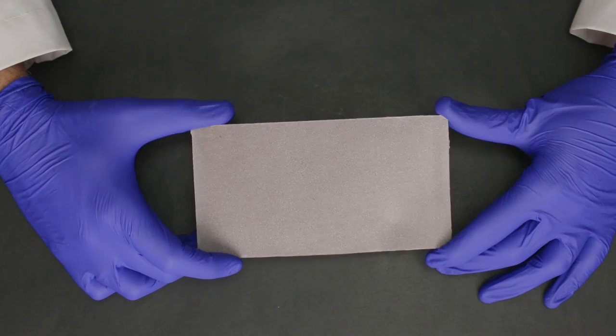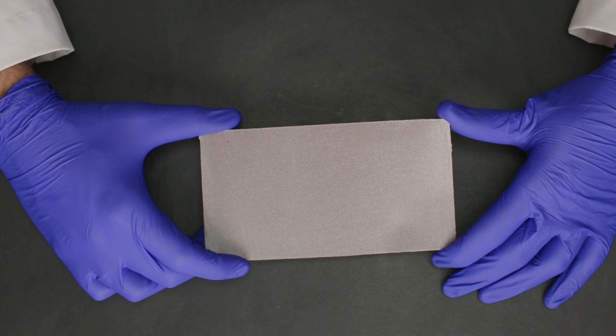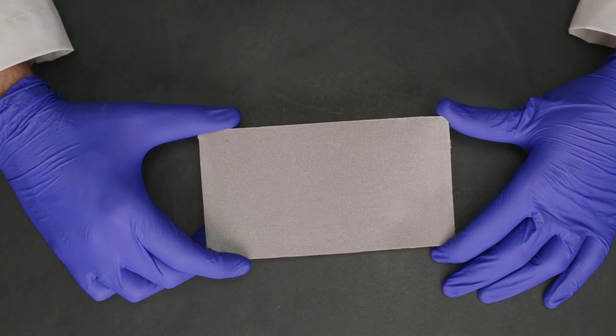One variation to modeling wax is alu wax. This has aluminium particles embedded in it which gives it the required rigidity, so it's a little bit better than modeling wax.